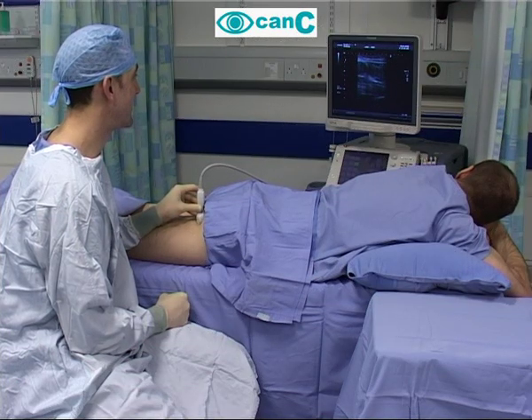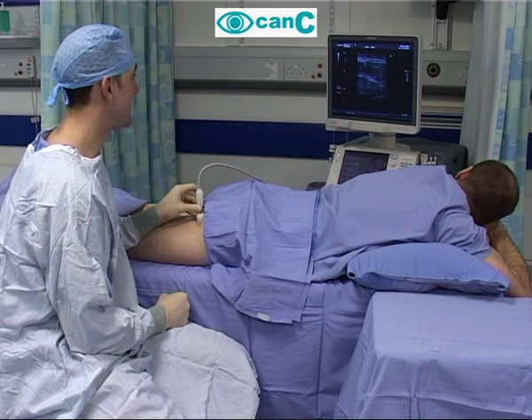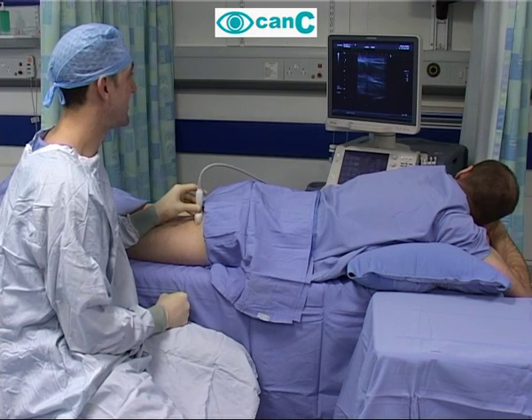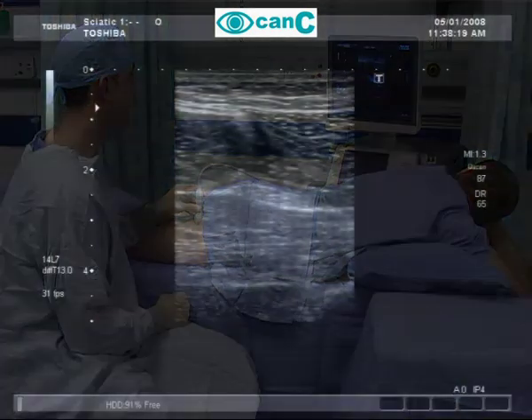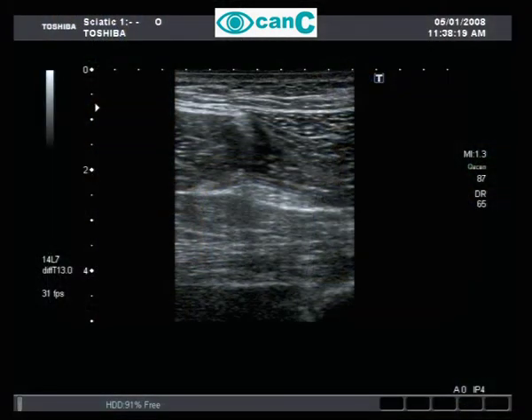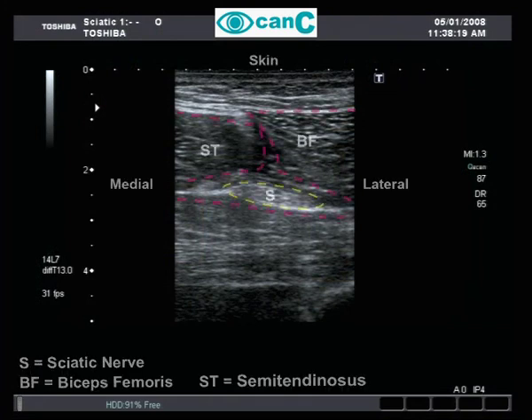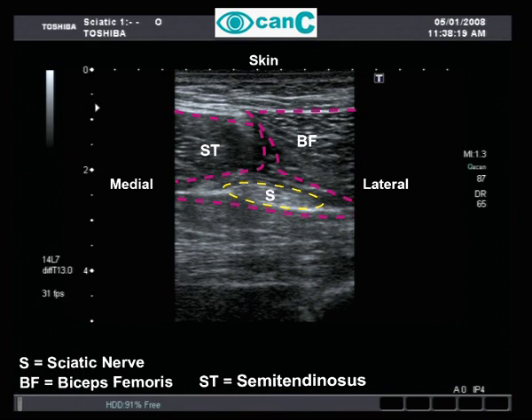With the patient prone, the probe is applied at the subgluteal fold. The best ultrasound image of the sciatic nerve is generated. The nerve appears as a white hyperechoic almond or triangular flat structure under the hamstrings.